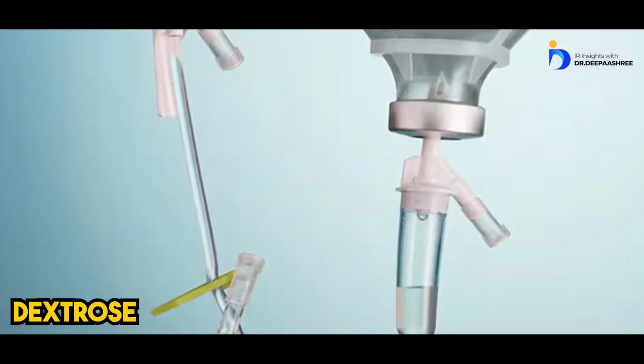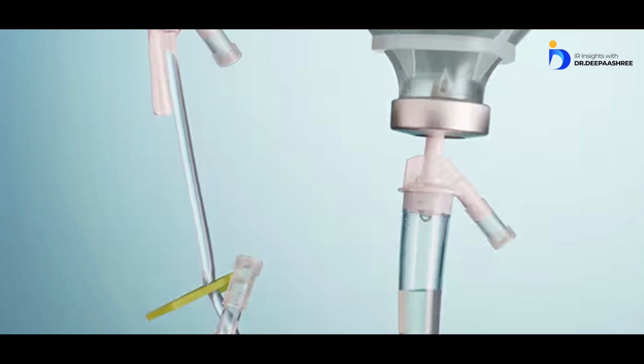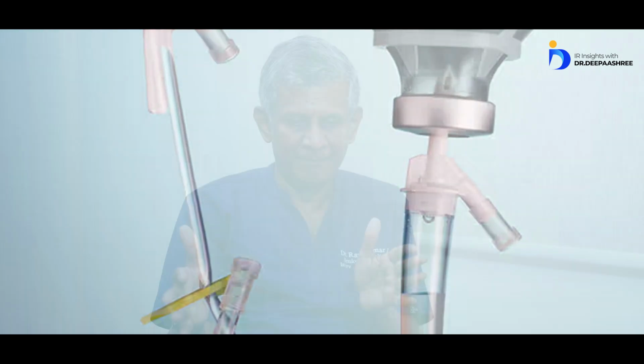Number one. Number two, dextrose has to be there. Take away all your saline particles, dextrose has to be there. Once the catheter has reached, there's going to be a time gap between the catheter already being there, where you have to embolize, and waiting because you're going to prepare the glue. So you turn off this side entirely and start preparing the glue. But mind you, blood keeps coming.